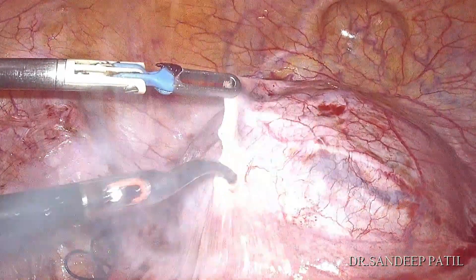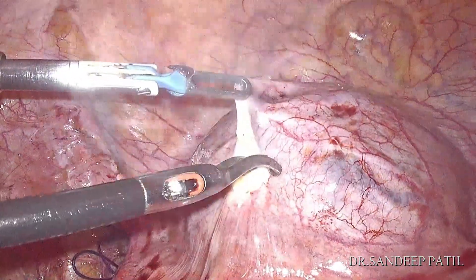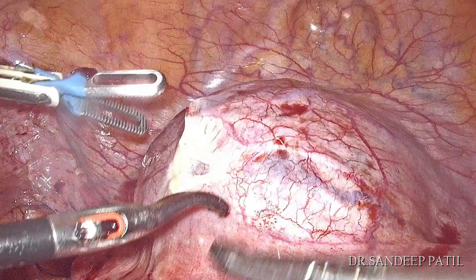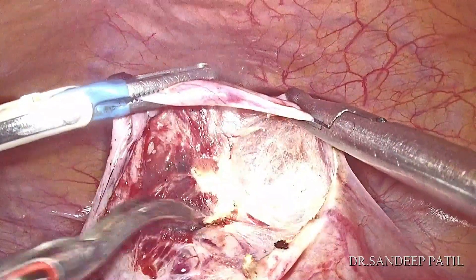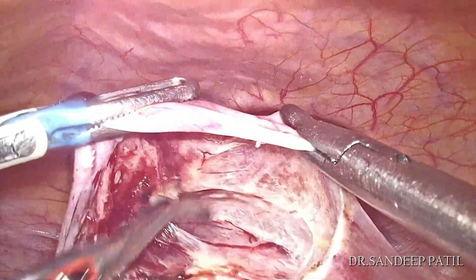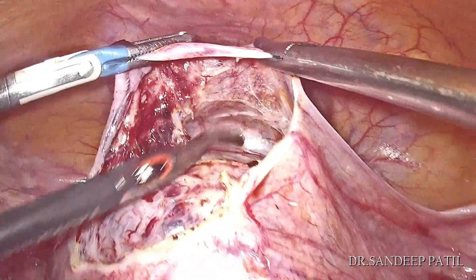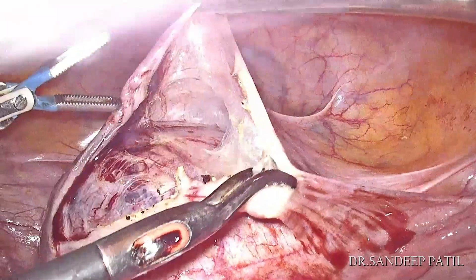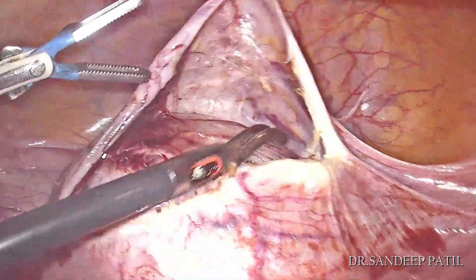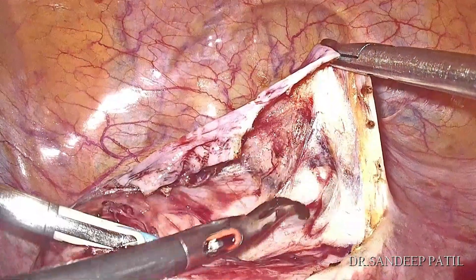The next step is to open the UV fold of peritoneum and separate the bladder from the underlying cervix. This step is very important to safeguard the bladder during myomectomy.